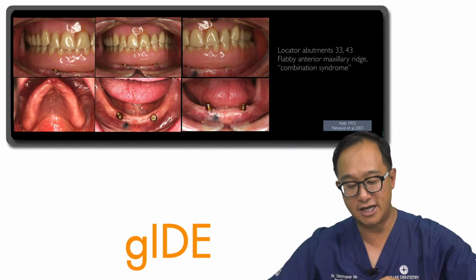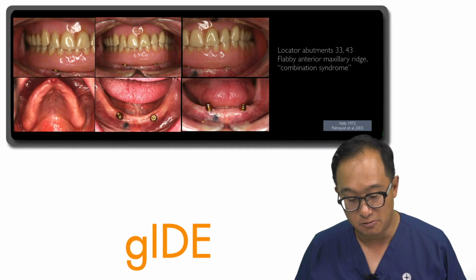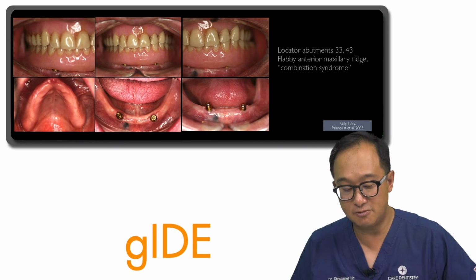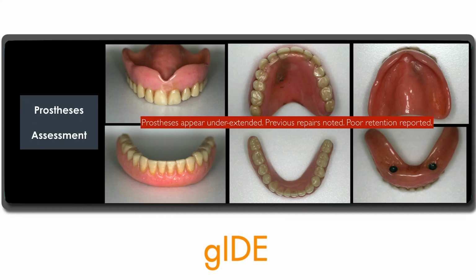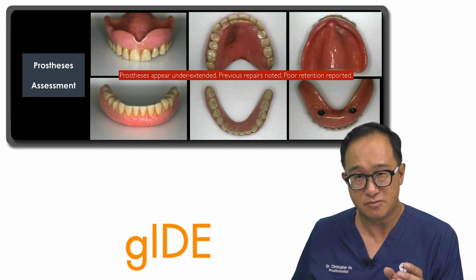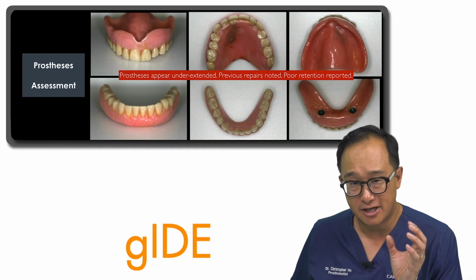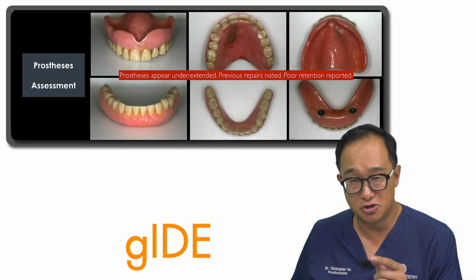When implants are slightly divergent and not parallel in nature, with these types of removable prostheses, it will wear the different attachments. Sometimes dentists think that implants will be the solution for a patient. And oftentimes implants will help in this type of case because it's an overdenture, it's only implant retained. So being able to fabricate well-fitting, well-supported dentures is probably the first and most important aim in your treatment.